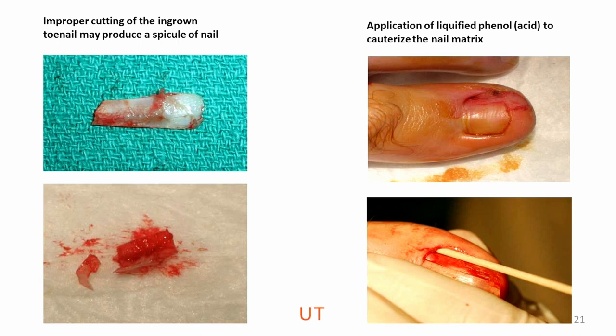Usually on a first visit you just do a toenail removal without killing the matrix. But if it's a second visit or a more severe form — say stage 3 of ingrown toenail — then you can do a matrixectomy. The most common method used is phenol. Here's an example of phenol being applied to kill the matrix: usually three applications over a period of one minute each, with separate applications. Change the cotton applicator every time you apply the phenol, and avoid having phenol drip on any part of the tissue, as phenol is an acid and can inflame the tissue.